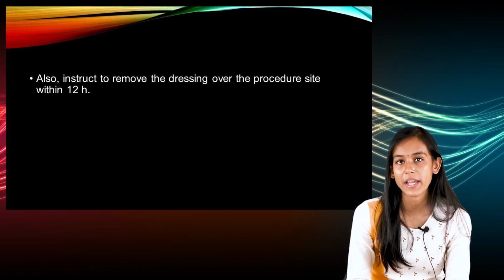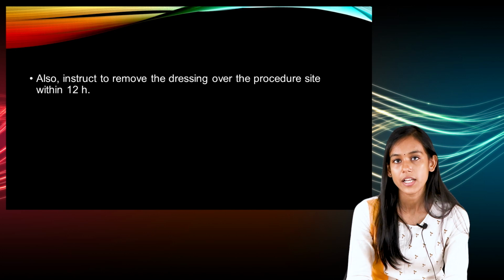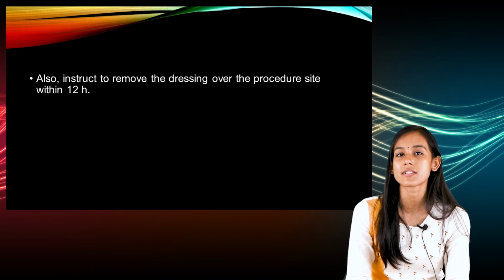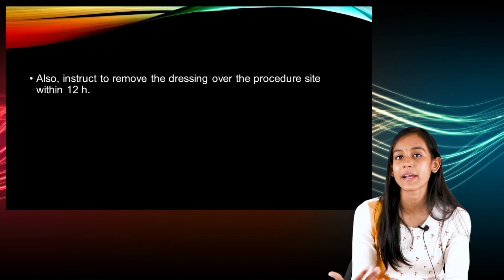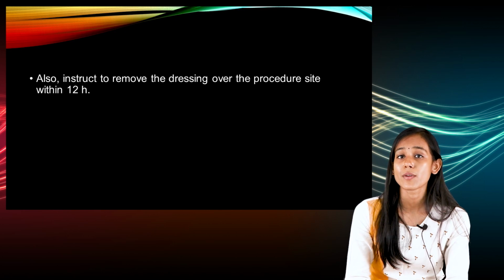Also, you have to instruct the parents to remove the dressing over the procedure site within 12 hours, because if it is left beyond that time, it might cause skin infection, and the child might get an infection. So to avoid that, you have to instruct the parents to remove the dressing over the procedure site within 12 hours. So this was all about the nurse's role before the procedure, during the procedure, and after the procedure.